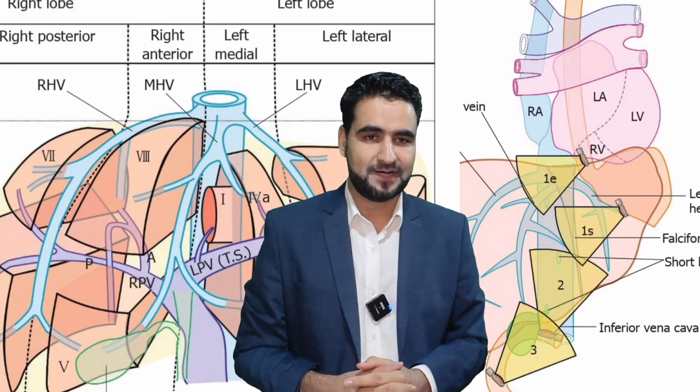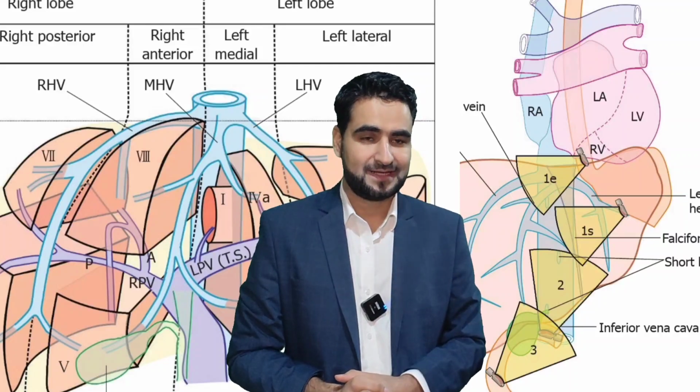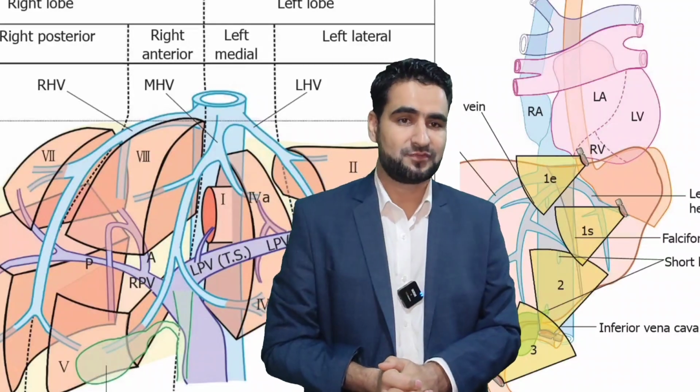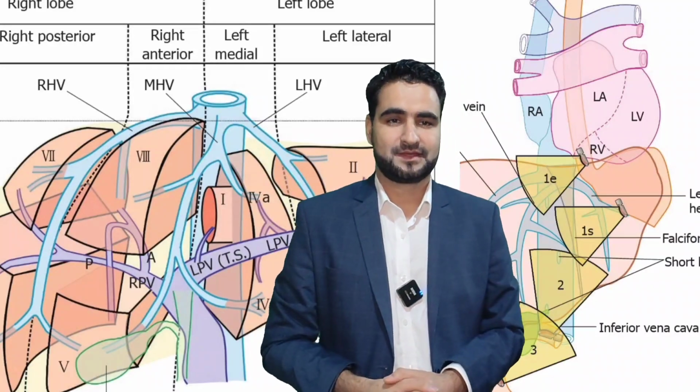In this session, we will explore an advanced but essential perspective in liver imaging, EUS from the descending duodenum. This approach allows us to visualize deep structures like inferior vena cava, caudate lobe, portal vein branches, and hepatic veins, and understand their spatial relationships during a counterclockwise sweep from the open position towards the right.